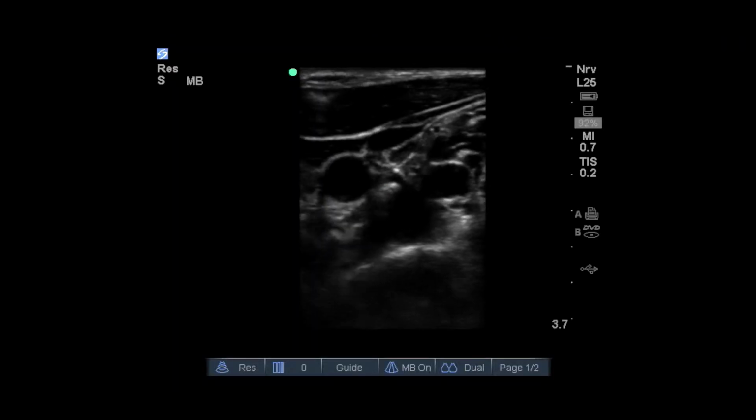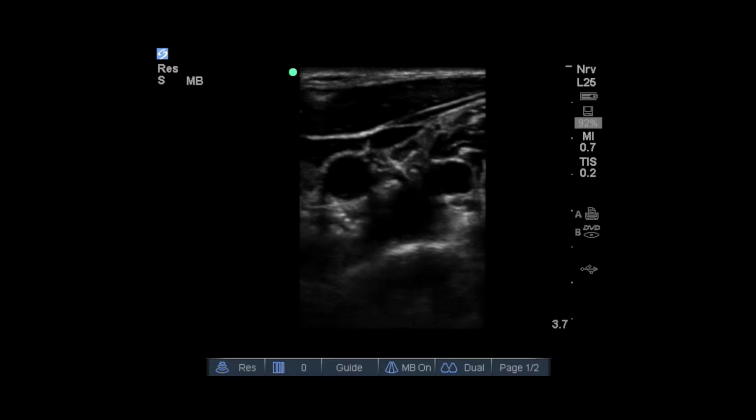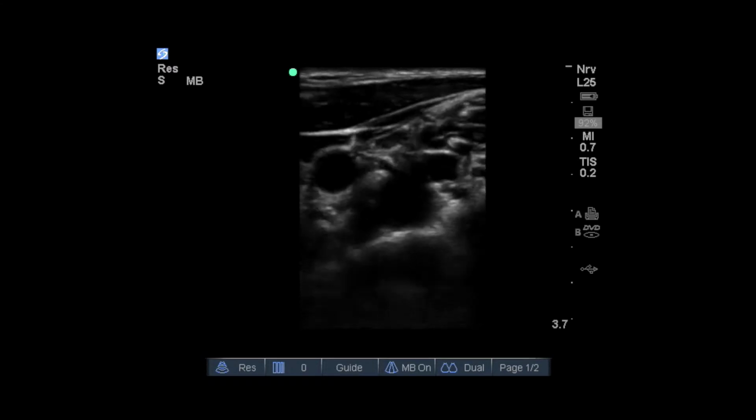At that time, we were using surface landmarks to estimate where you expected that vein to be. Even with ultrasound assistance, there are still challenges to placing a central line. You don't know where the tip of that needle is. You're looking at adjacent structures and the movement of those structures, such as fat, tissue, planes, as you're advancing the needle to guesstimate where that tip of that needle is.